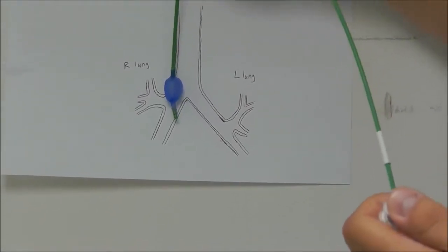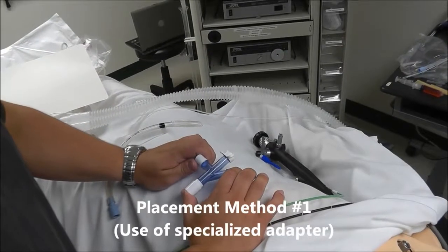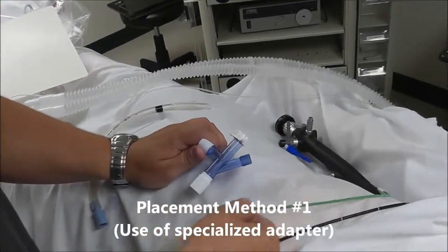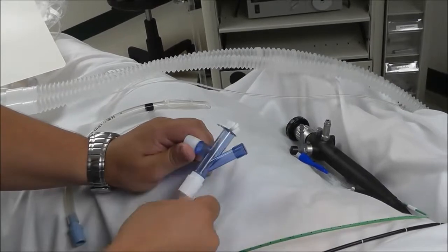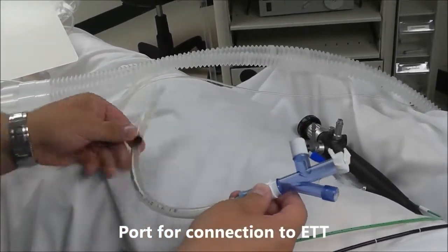Let's look at some of the other materials and setup and placement of the bronchial blocker. One method of placing this bronchial blocker utilizes a special adapter which comes with the bronchial blocker itself. As you notice, it has 4 ports. The bottom port connects to your endotracheal tube.